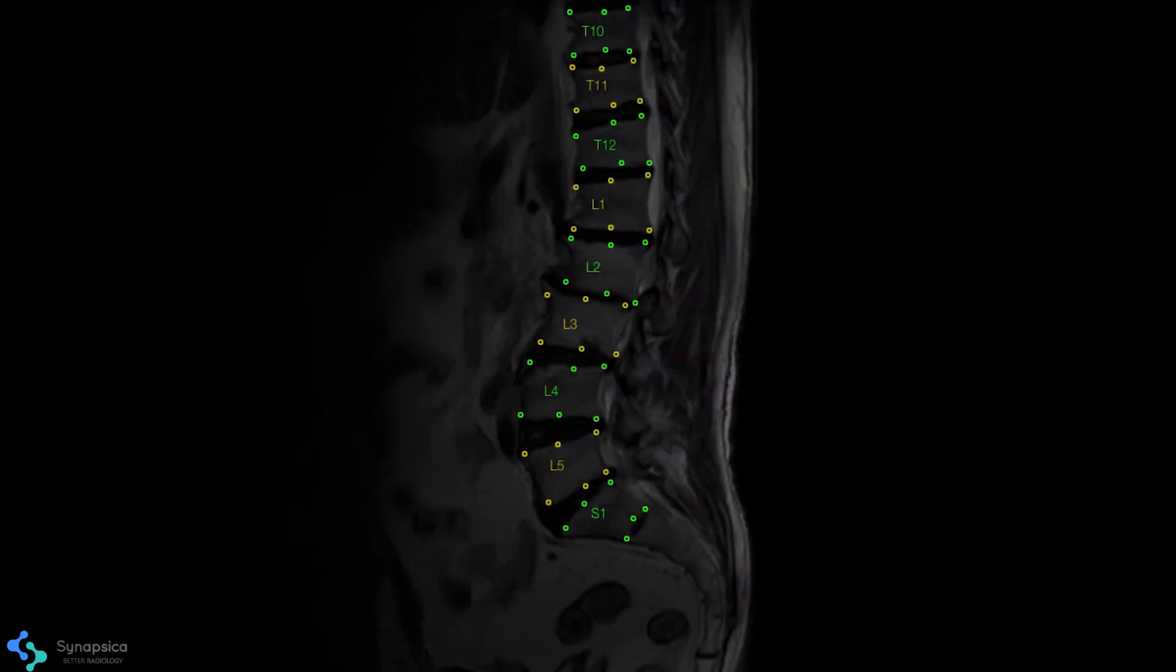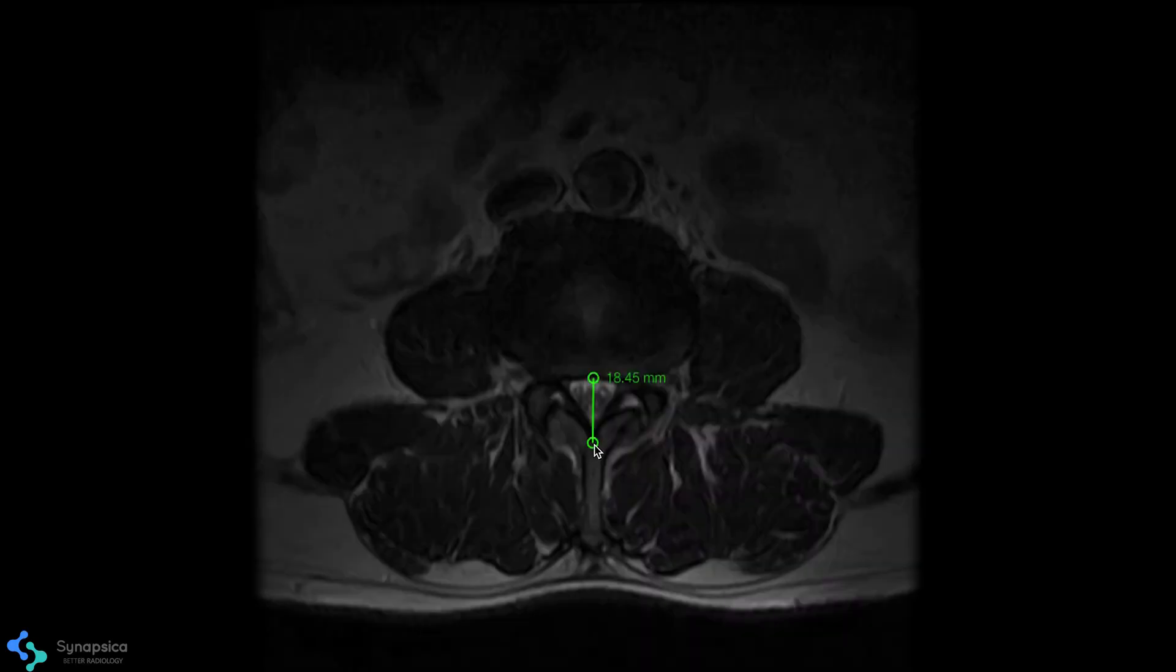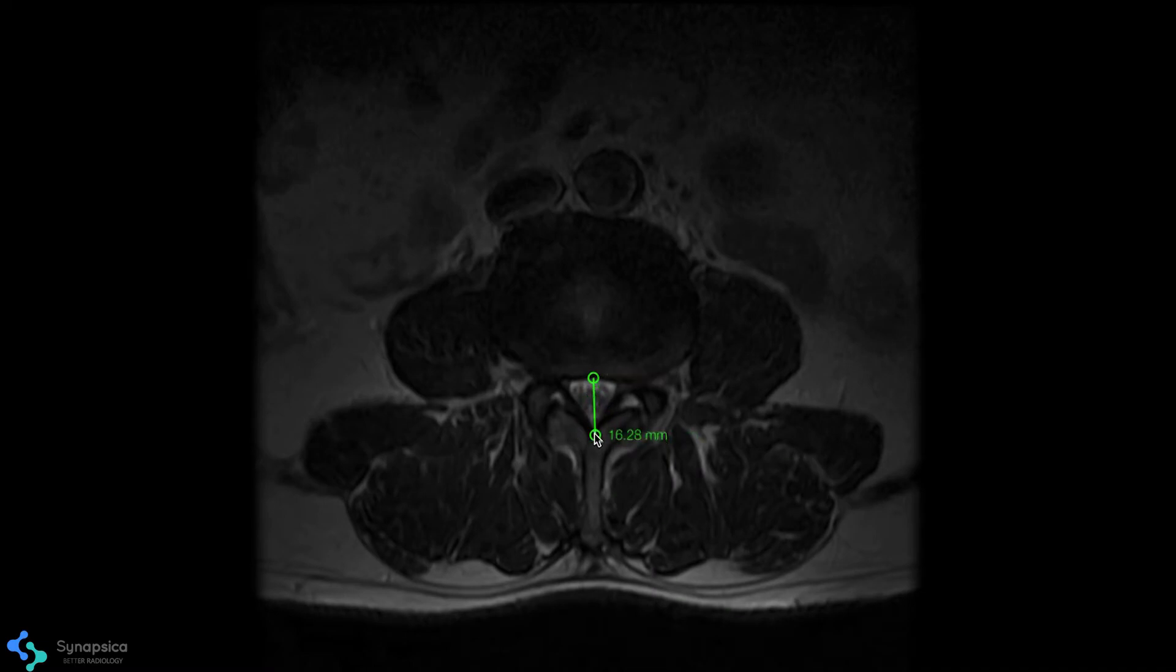Spindle automatically segments vertebral bodies and labels them accurately, even in presence of congenital abnormalities. It evaluates spinal stenosis and quantitatively measures the central canal and thecal sac diameters.